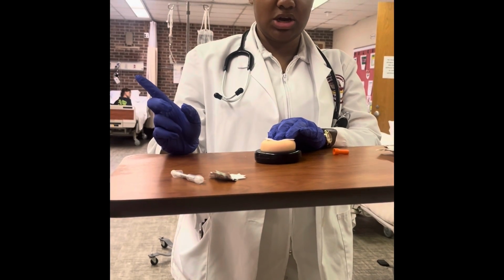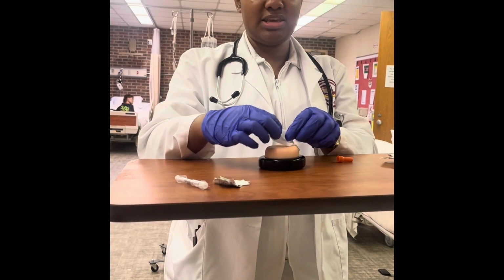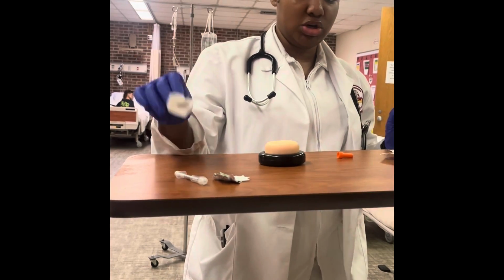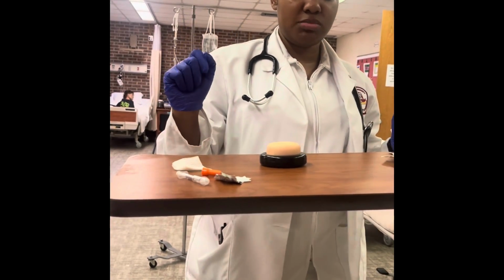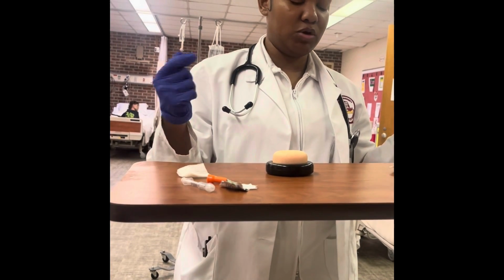Make sure not to massage the medication. And you just want to gently apply pressure. And then I can tape the gauze down if needed, in case of bleeding. But I'm going to trash it for now. Okay, next we're going to be doing your IM or intramuscular injection. I'm going to pull your shirt back down and pull your blanket back up.